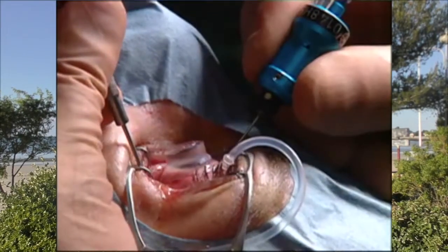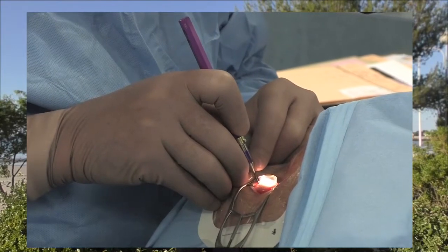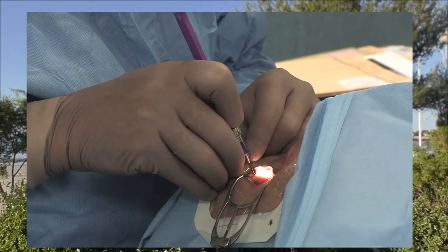For ILM peeling, you don't need to hold the membrane with one hand to cut it with the other. But the free hand can make peripheral scleral depression if you decide to perform a complete vitrectomy, center the planoconcave lens, turn the wheel of the forceps to present the jaws perpendicular to the edge of the membrane, and spatially stabilize the forceps to avoid trembling movements, increasing the precision of the work. What do you do when you play Mikado with a child? You hold your arm with your other hand to increase precision. The surgeon's precision increases, he appears very skilled, never making retinal touch, and the surgery becomes faster.